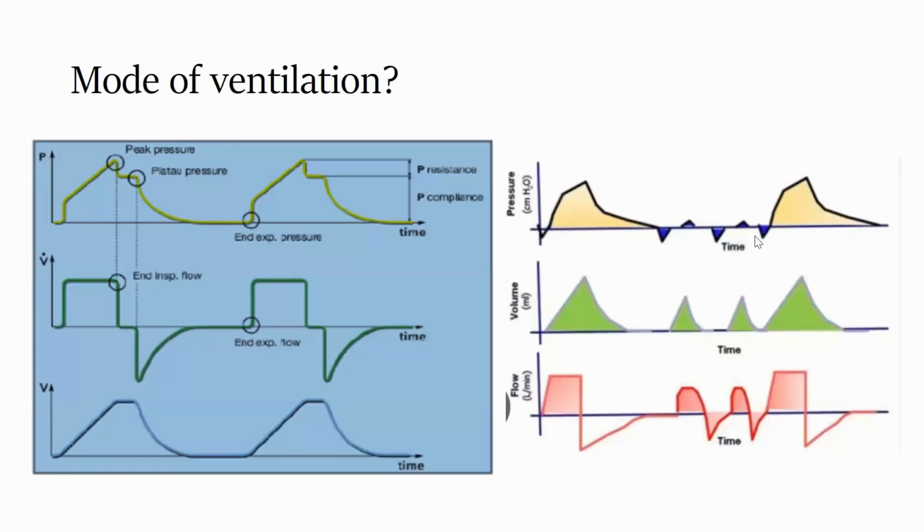So it will synchronize. If the patient breathes in that 0.5 to 1 second synchronization window, it will count it as a mandatory breath and it will assist the patient's breath. Otherwise, if it comes in between, well away from the synchronization window, it will allow the patient to breathe on their own. So that's why it will enhance respiratory muscle function. It will prevent ventilator dependence. So even though it's not that advisable a mode for weaning, it can be used.